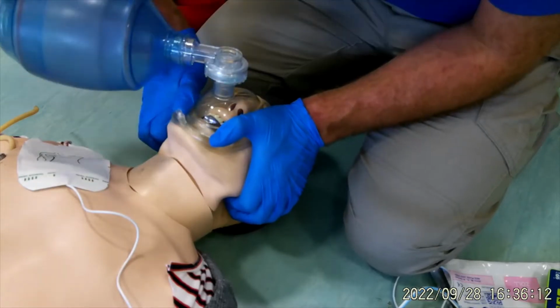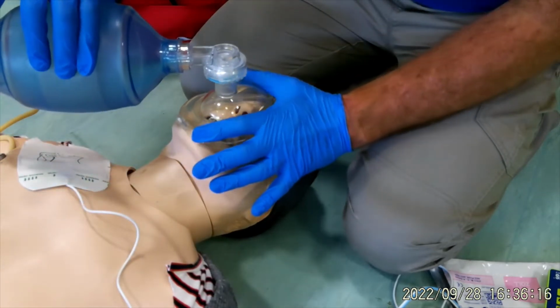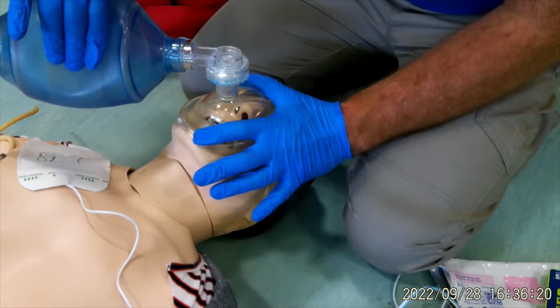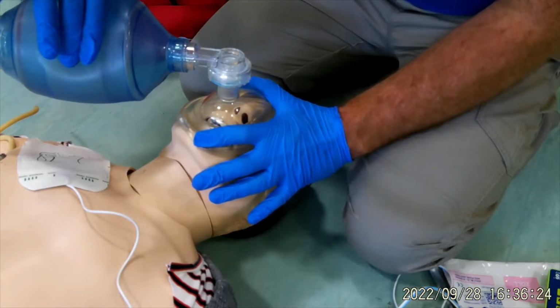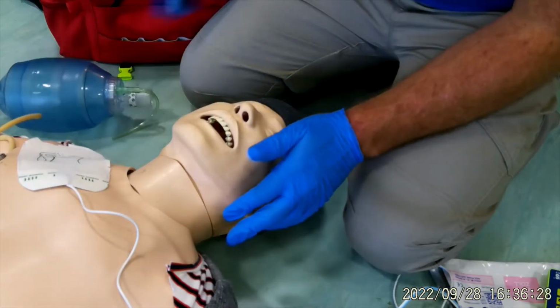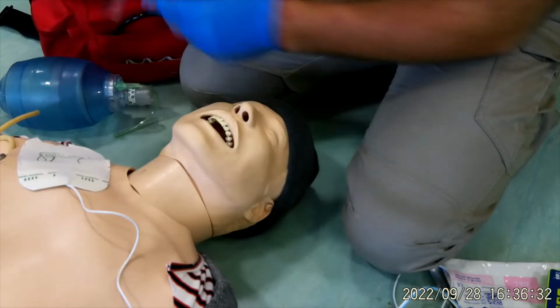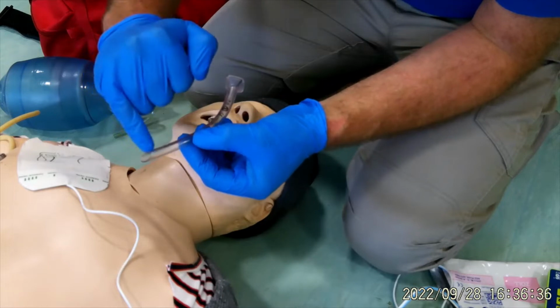So they would squeeze the bag and they would just do about 1/3 of the bag over 1 second, and they would do 2 of those. If I wasn't happy with the airway, I could then escalate up the airway and I could look at using a nasopharyngeal. So with my nasopharyngeal, they've got a curve to them and there's a flange at one end.